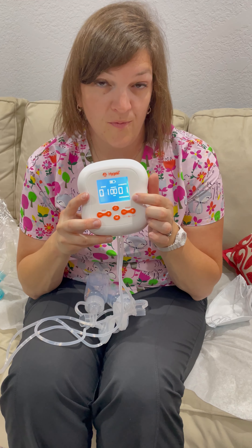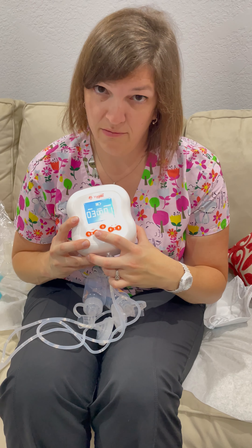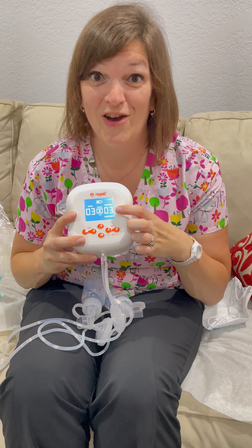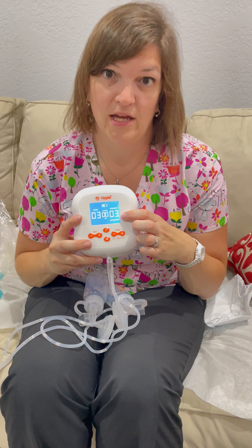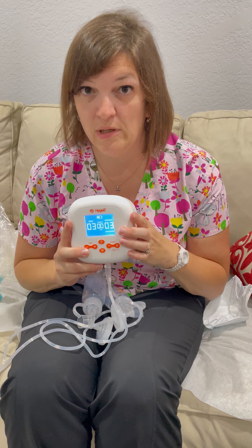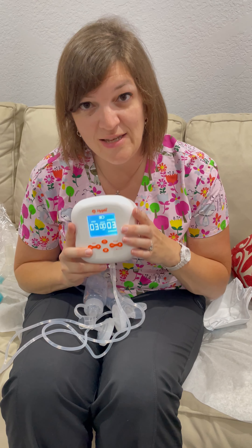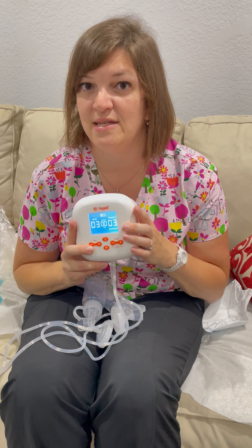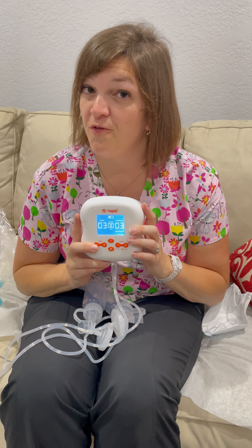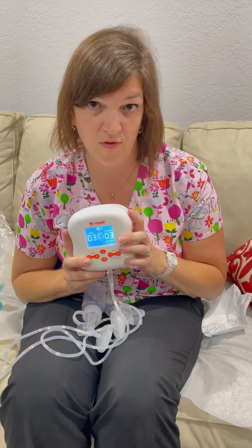When you have colostrum for the first two or three days after birth, you're going to want the speed somewhere around two or three. You don't have to have it very high in the beginning. You want the suction strength comfortable, but not sucking too hard because we don't want to do damage to the breast. In the days of colostrum, you will get much more milk with your hands and hand expression than the pump. But the pump is really good at stimulating the nipple to trigger hormone responses to help get that breast ready to start to move milk. So what I normally recommend is use the pump first to get your hormones stimulated and then use your hands to actually remove the colostrum.